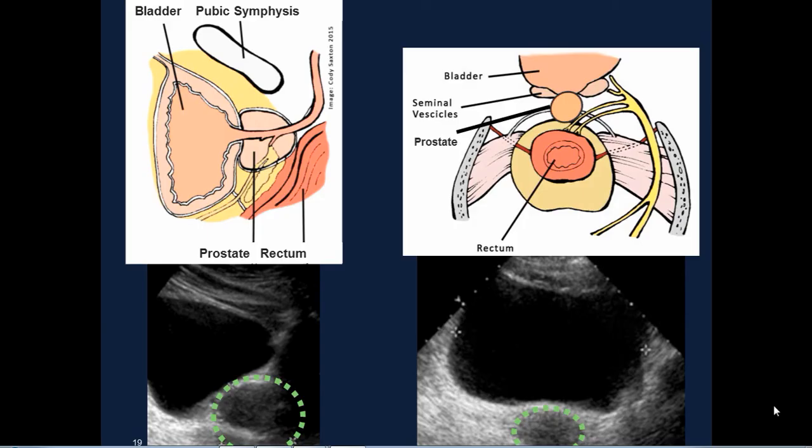the organ. Similar to the illustrations of the female bladder we looked at, these are renderings of the male anatomy in both the sagittal view on the left of the screen and the transverse view on the right. Depending on the level of the probe in the transverse view, you may see the seminal vesicles or prostate deep to the bladder. Make sure to scan all the way through the bladder to try to find both.